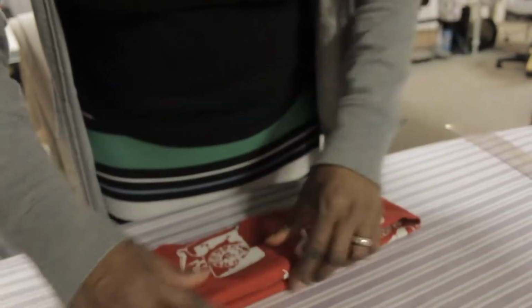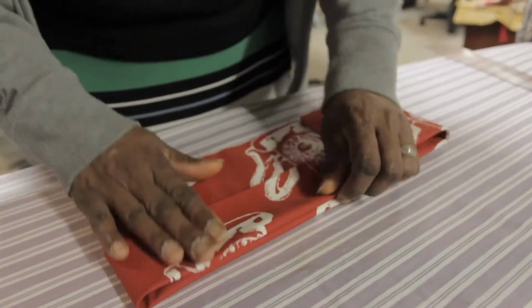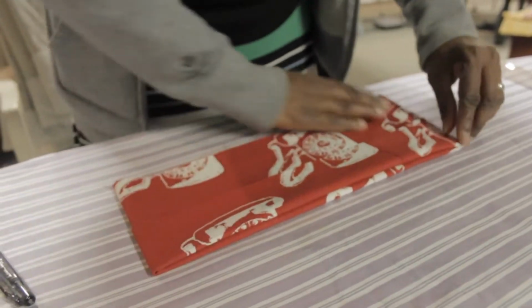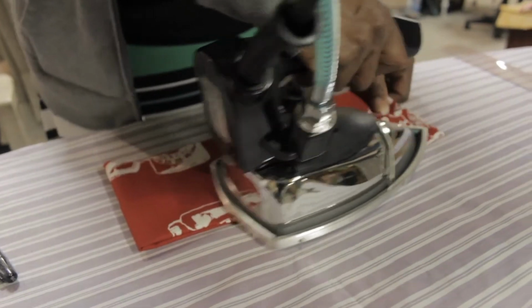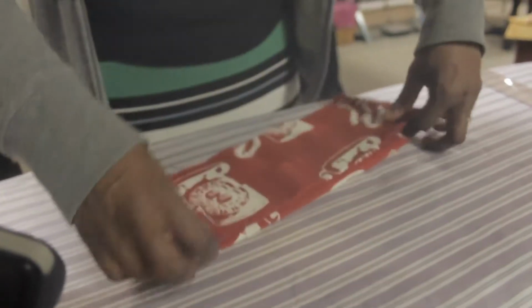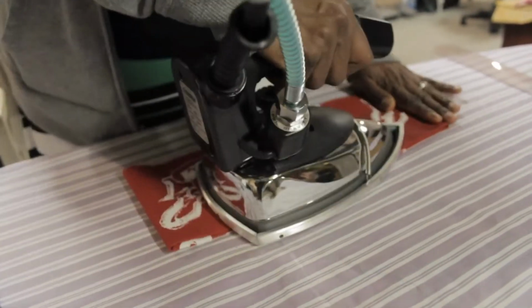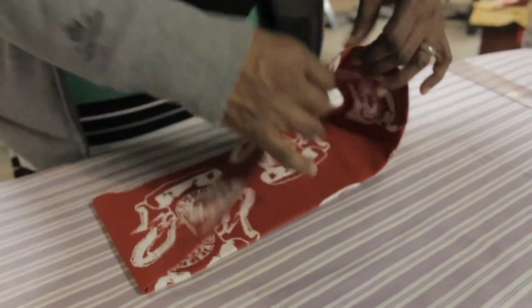Okay, so there's my line, and I just make sure that the cuff is all 2 inches wide, and I'm going to press again just to hold that cuff in place. Give it a good press. Now we move over to our sewing machine.